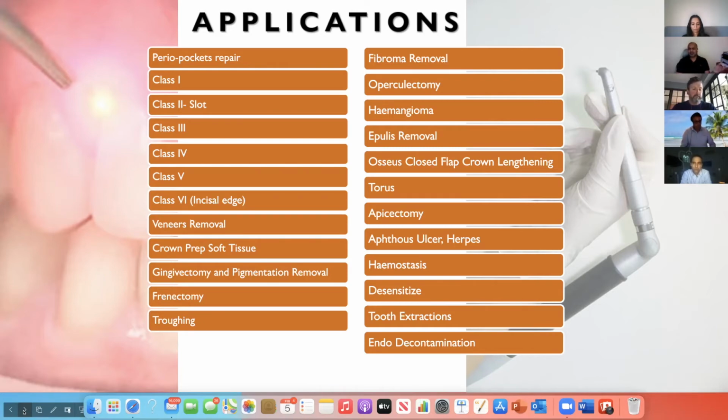It makes life so nice for a patient. And then the healing is another story. For us as dentists, that is very important, because we want a minimal amount of infection and a maximum amount of healing post-op, and that's another concept that is again enhanced by dental lasers. Okay, good to know.